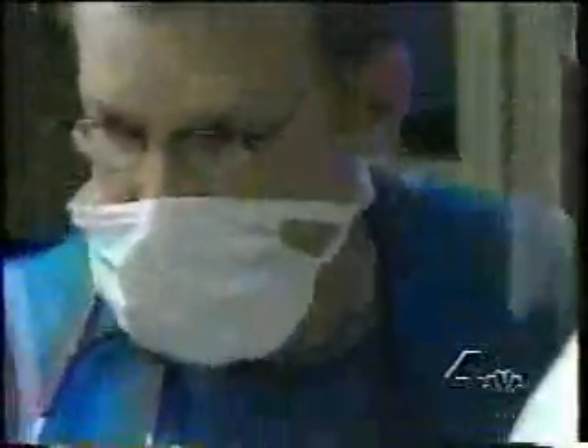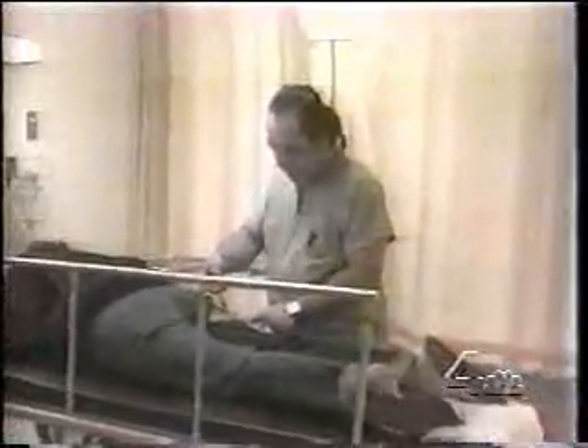It'll happen millions of times a year, especially during holiday weekends. Someone suffers some kind of cut or laceration that'll take stitches to close. And no one, kids or adults, likes stitches. But what if you could use something like this — glue — to close the wound instead of stitches?